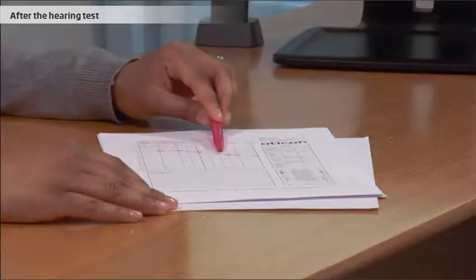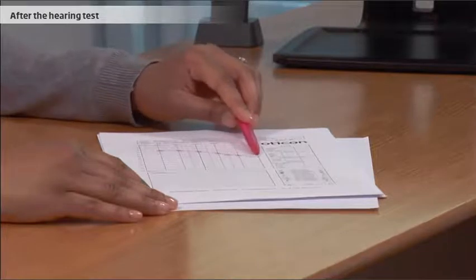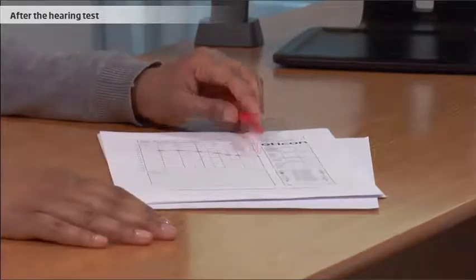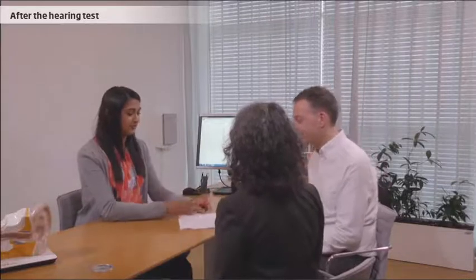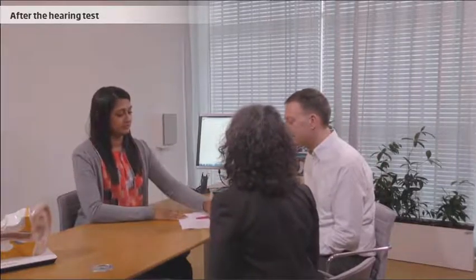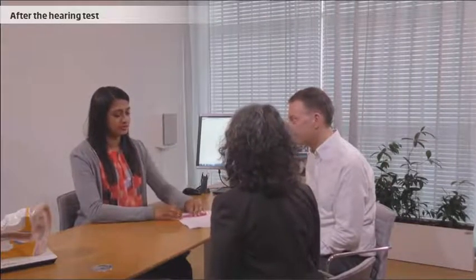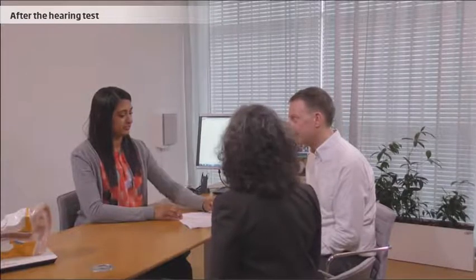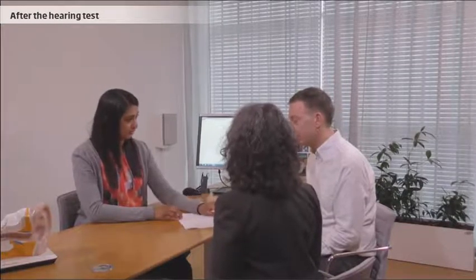After the hearing test, the hearing care professional will present the results to the client. These results are shown on what is called an audiogram. The audiogram provides the hearing care professional with an understanding of the client's hearing ability. This is a good starting point for discussing hearing solutions and treatment plans available.